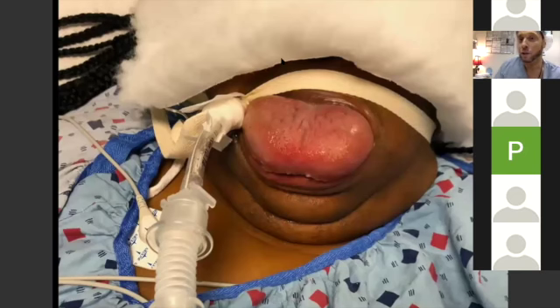And you will all be called for this patient. You will all have this patient. You'll be called down to the ER any time of day or night, and the patient will be having their tongue out of their mouth. You'll have to make a decision. Am I going to push some propofol and hope for the best, or am I going to take the safer route, which is to topicalize and do an awake technique? I've been called here at this center 3-4 times already for this scenario. So I just grab the adult fiber optic, run to the ER, topicalize, touch of sedation, and proceed.